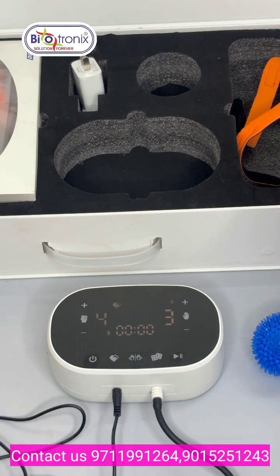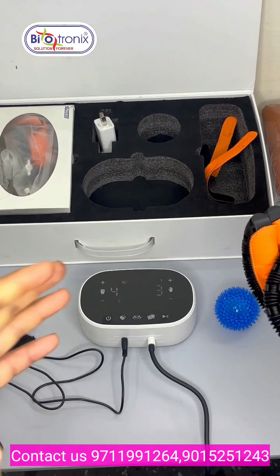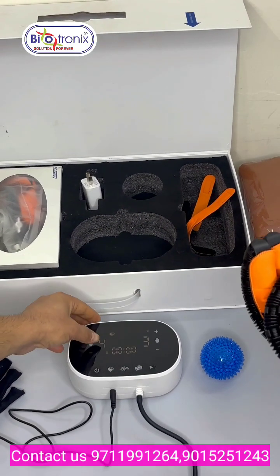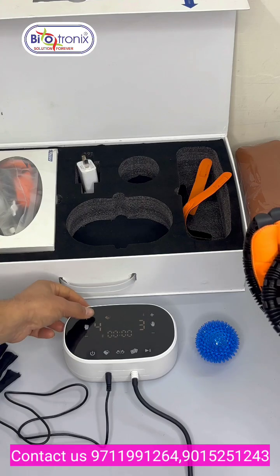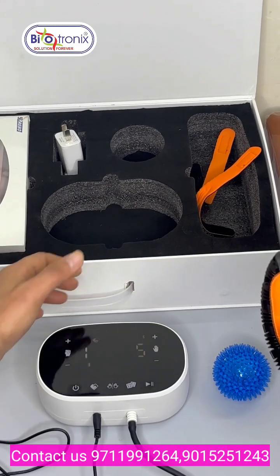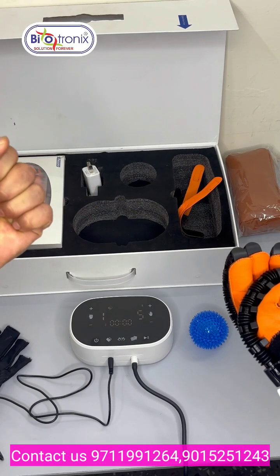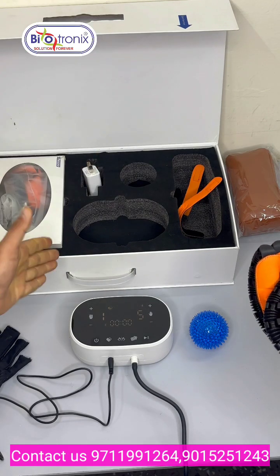In the passive training mode, the rehabilitation glove will flex and extend passively using this host device. You can also adjust the timer for the hold time of the flexion and extension. You can increase or decrease the timer from 1 to 9. So this is the hold time: the rehabilitation glove will flex and hold for this time, and then extend and hold for this time.